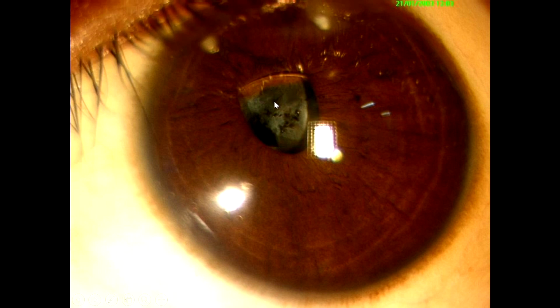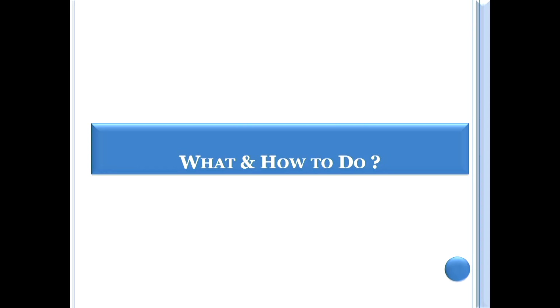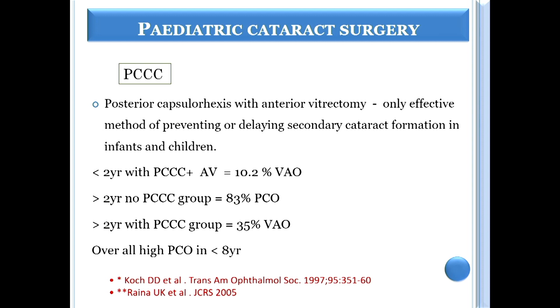Sometimes when the anterior capsular margin is not overlapping nicely, then the iris can have a synechia because of inflammation in these cases with the capsule. There can be decentration and optic capture of the IOL. So all these things can happen, and PCO is something which can have a very diverse presentation and very significant implications.